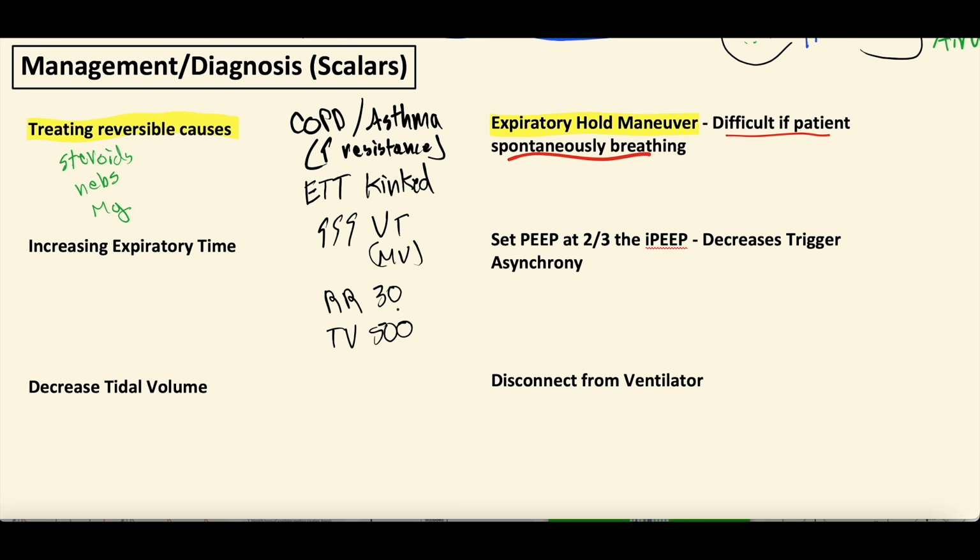Well, as we said, a respiratory rate of 30 means that they get one breath every 2 seconds, no matter what. We're telling the ventilator, we want you to give that breath no matter what. And their tidal volume of 500. So even if they don't have that prolonged of an expiratory phase, that can certainly mean the patient breathes in, volume scalar is breathing out, and another breath comes in, right? Out, another breath comes in, out. And that can cause them to AutoPEEP because they simply don't have enough time to breathe out that amount of tidal volume in 2 seconds.